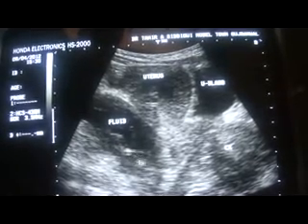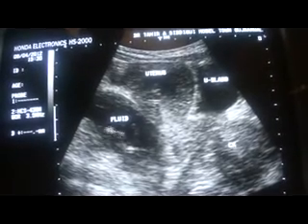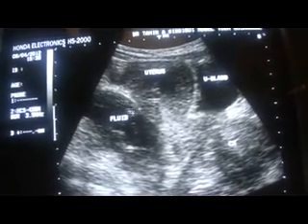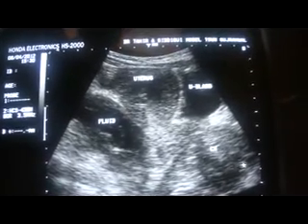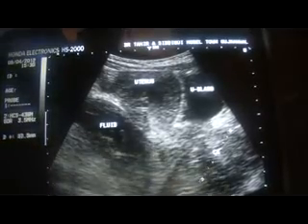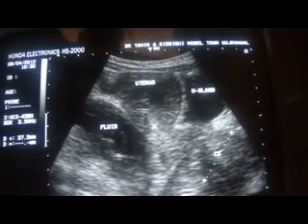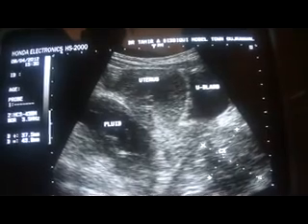He had an abortion from an unqualified person, LHV, or in our areas, really people go to. Now I am focusing only on the endometrial canal.